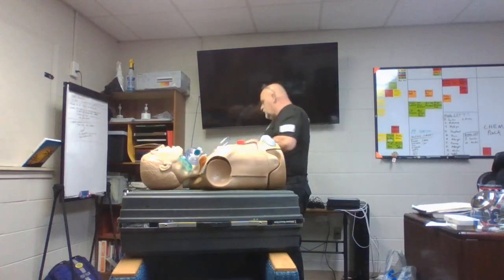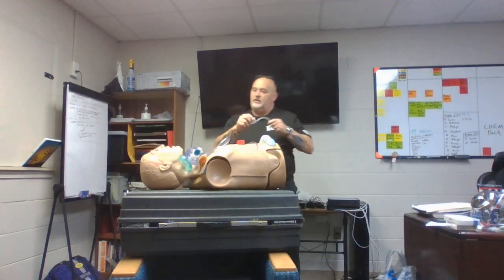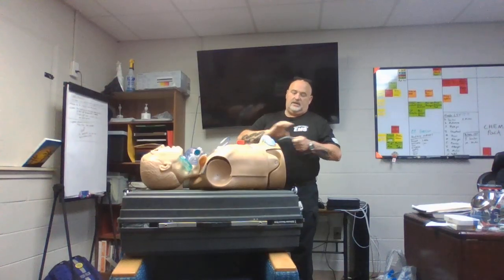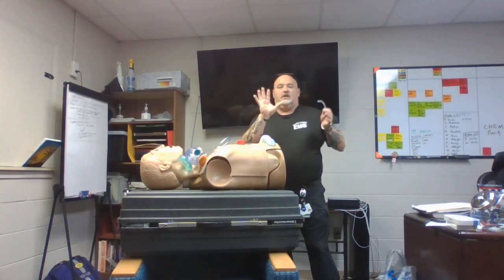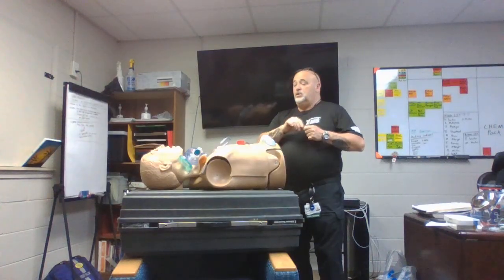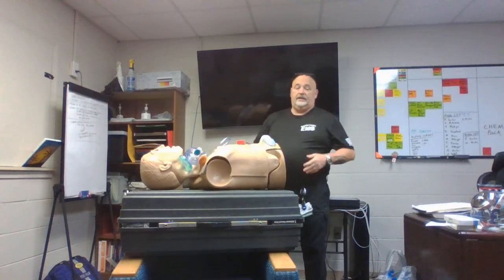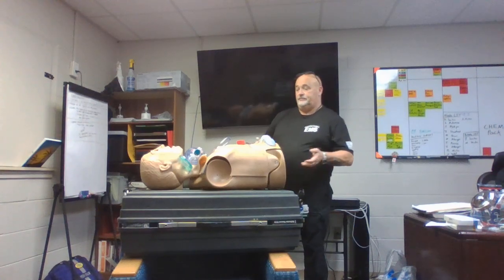You lube them up. You take a little bit of airway lube. You just put a little bit on there. What you don't want to do is coat it, right? What do you have on? Gloves. So when you coat this thing in lube, guess what's all over your hands now? The lube, and you won't be able to hold on to anything. The bag, the trumpet, anything. It's all going to slide around.